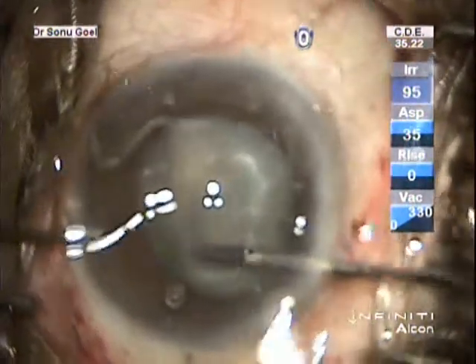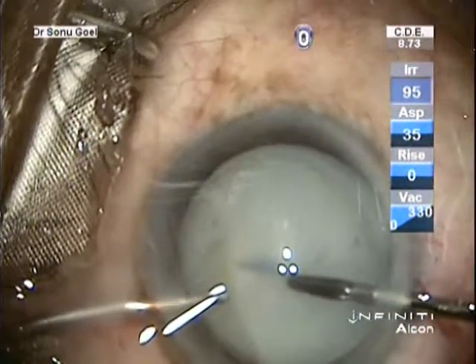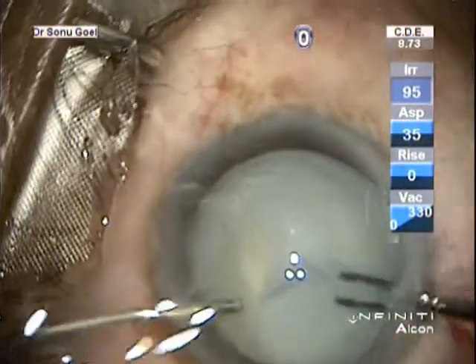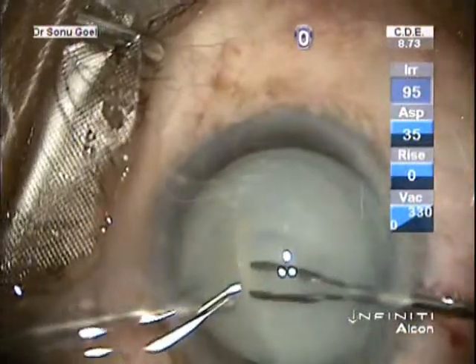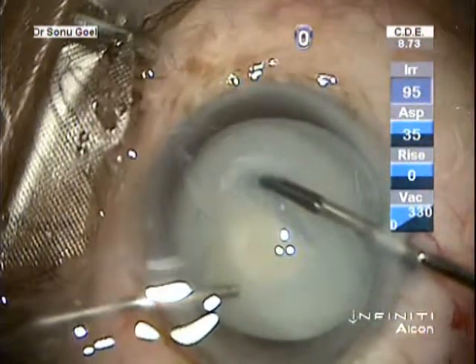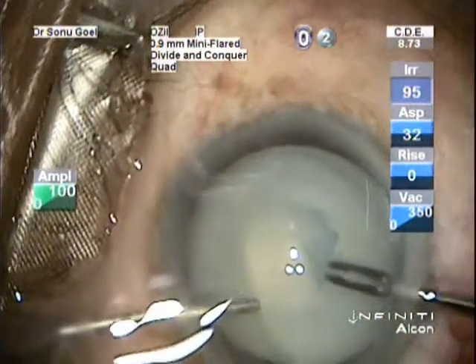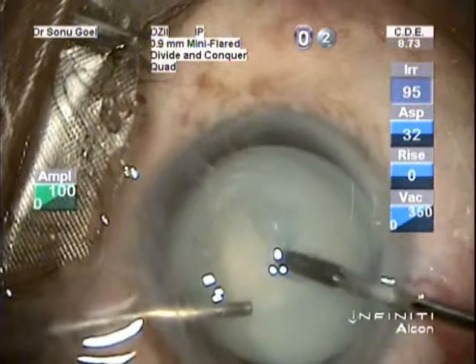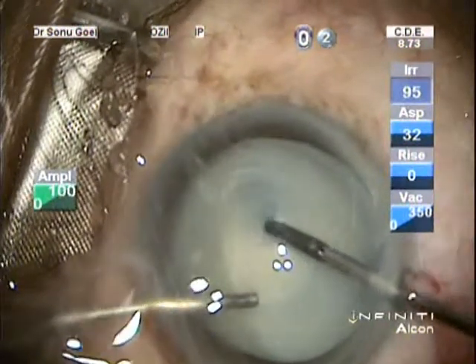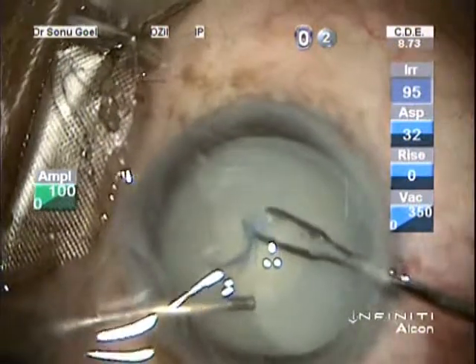See the white milky cataract, continuous viscoelastic through the side port, maintaining a positive tamponade, and the rhexis can beautifully be completed. So this innovative technology that we have introduced, maintaining a positive pressure from the side port, helps in achieving rhexis in near total cases despite there being a high intralenticular pressure.